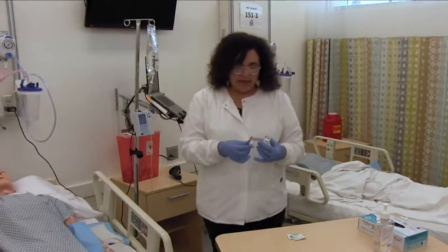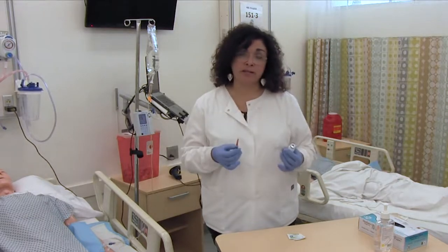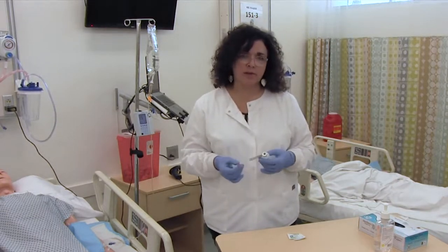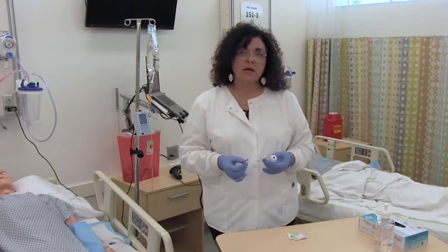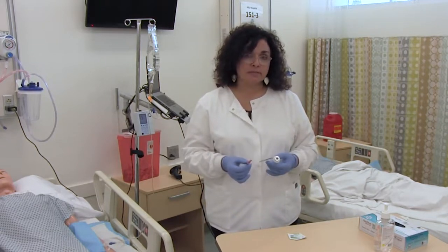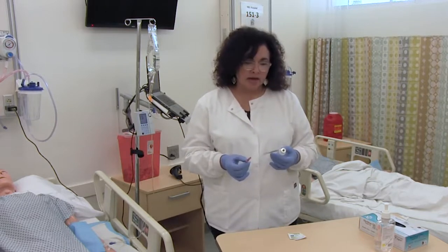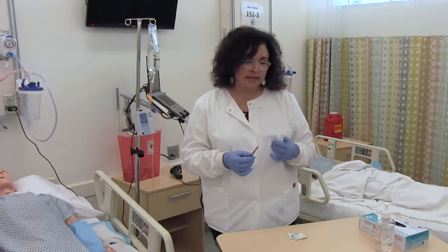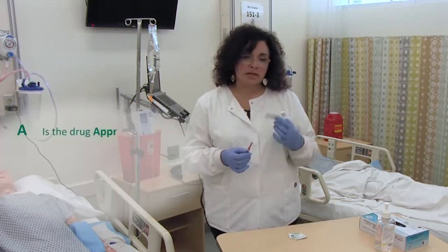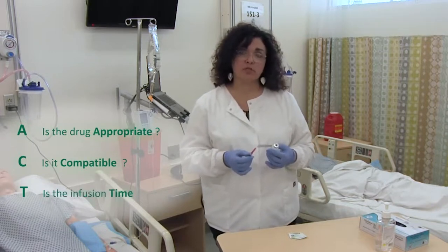And then with that, I take a moment of pause, and I'm just going to run through my checks and balances. I checked two unique identifiers, allergies, 3 checks of the medication against the EMAR. I scanned everything in, and then with regard to IV push, yes, it's appropriate, yes, it's compatible, and I have a 1-minute time over which to push.